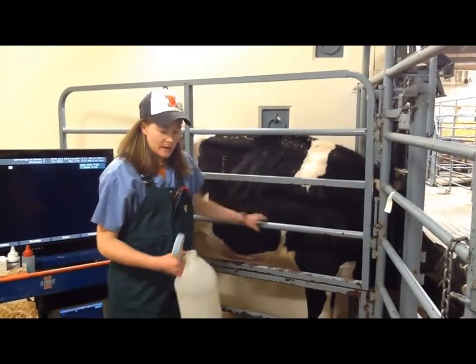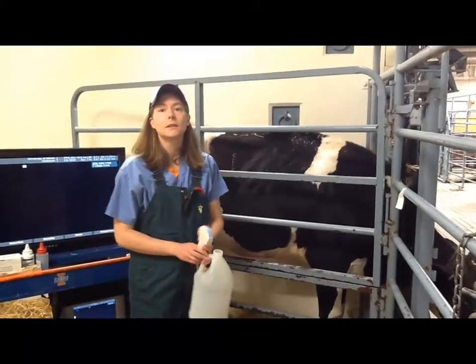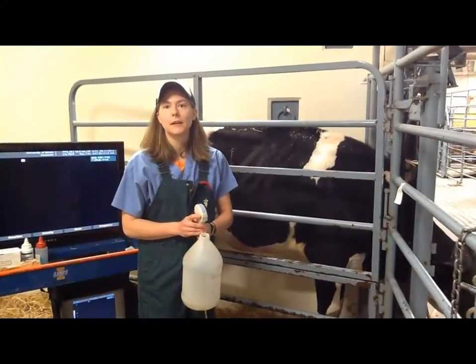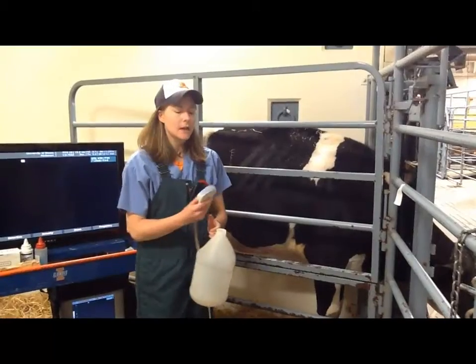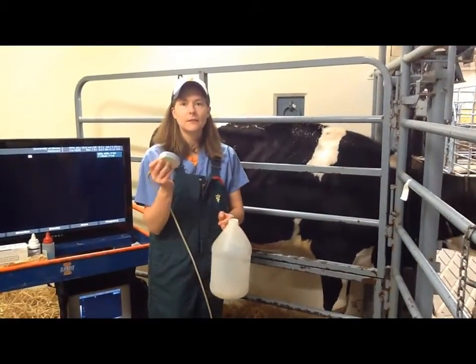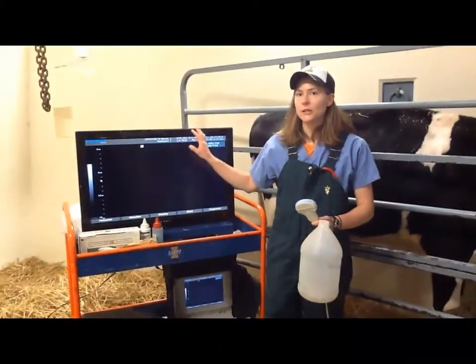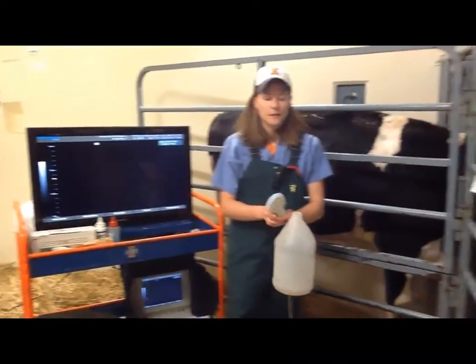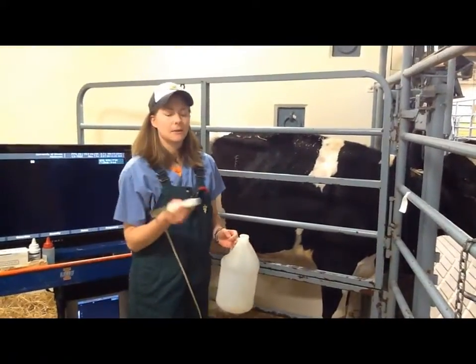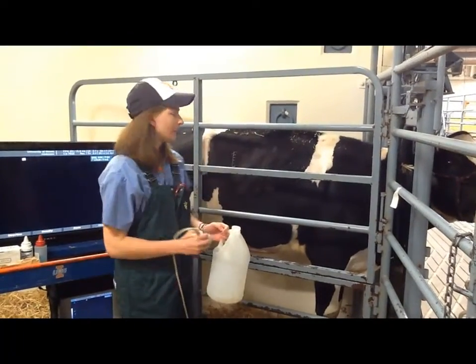Out in the field, you might be using a rectal probe that's used for doing ultrasounds out on the farm. This is a little bit more advanced and allows for deeper penetration into the tissues. But just out in the field, you might be using a rectal probe instead of this fancy one we have here today.